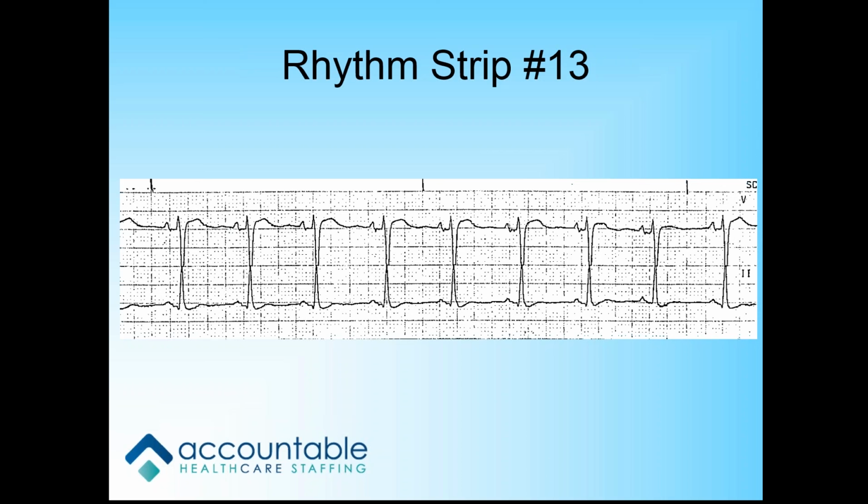Don't go just by that rhythm. When I used to be a preceptor, it's going to reinforce going to your patient first, I know how to mimic VTAC on a lead on a stable patient. So always go and check your patient. Okay.